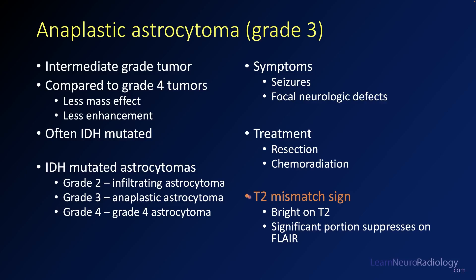The T2 mismatch sign is something that's been published relatively recently but may show up in a testing scenario. This is when you have a tumor that is very bright on T2 but has a significant portion that suppresses on FLAIR. This is a pretty specific sign for an IDH-mutated astrocytoma.